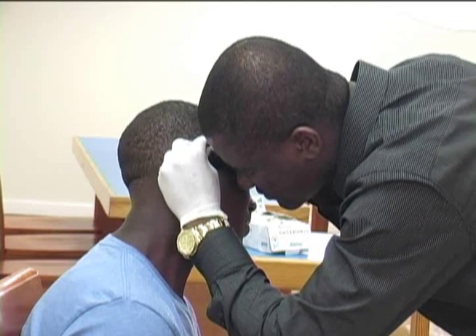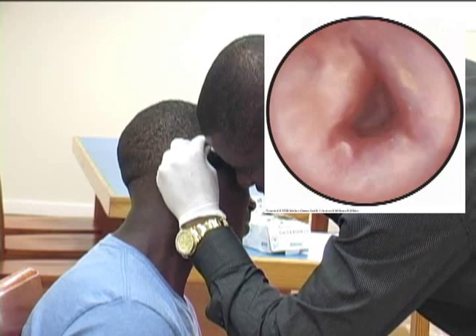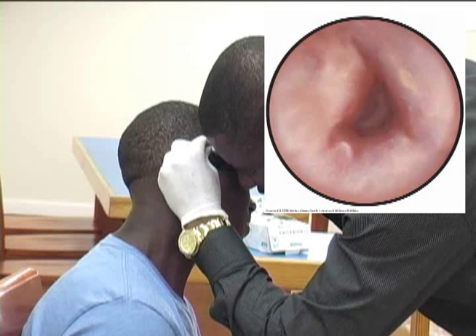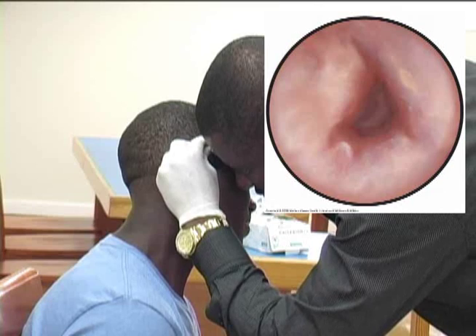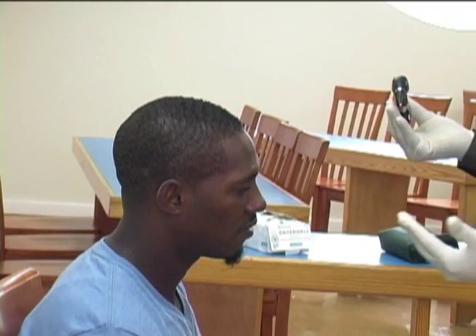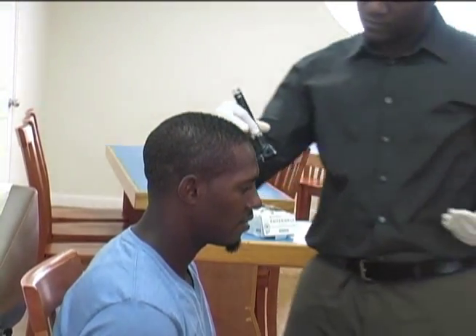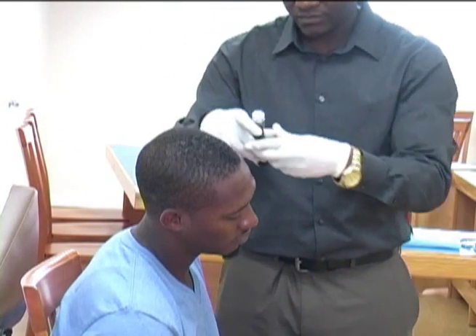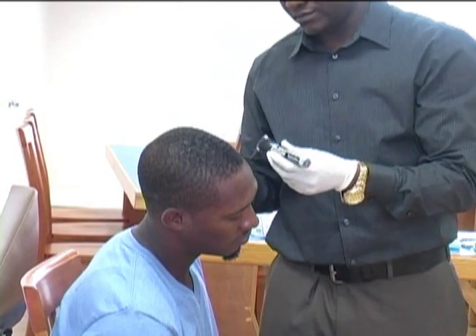Color. Diseased tympanic membrane may be dull, yellow, or red. Redness may indicate inflammation or otitis media or recent trauma. Blurring and dullness of the tympanic membrane. Distortion of normal landmarks.